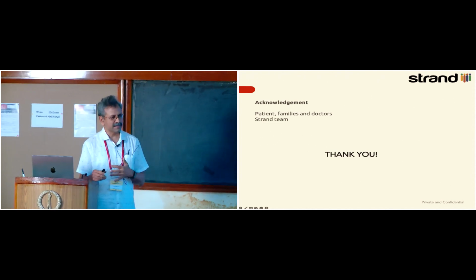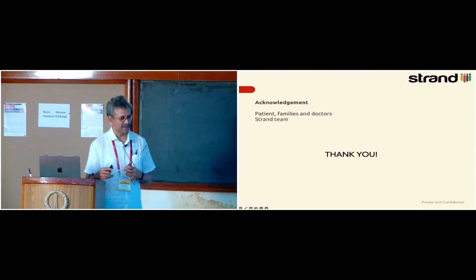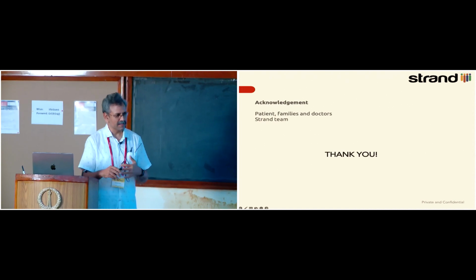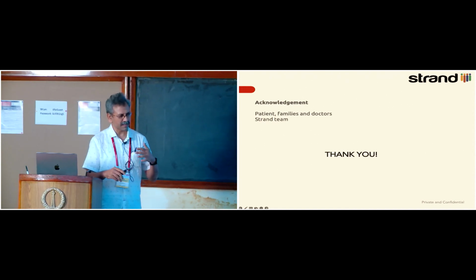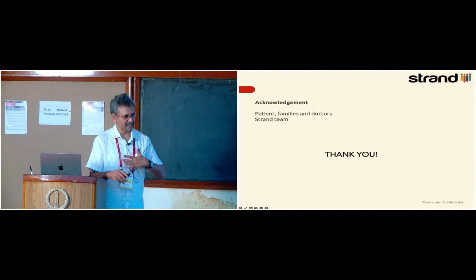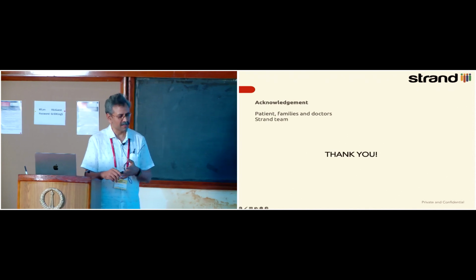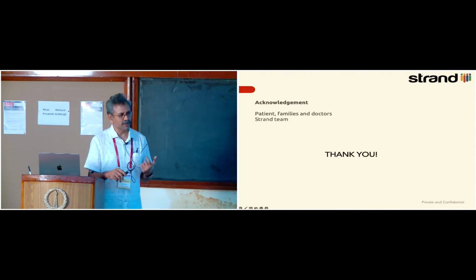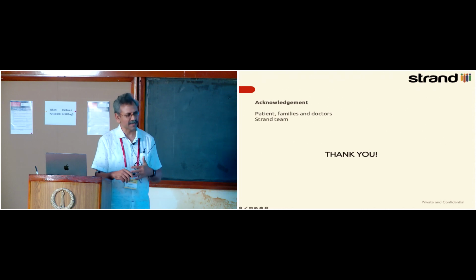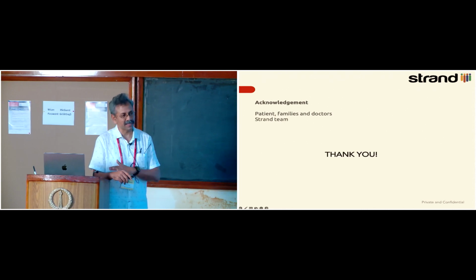Many of the clinicians that we interact with want to give an answer to a patient in a fairly short amount of time, so they are more interested in likely pathogenic and pathogenic variants. Even amongst the variants of uncertain significance, we have 5 different tiers in our internal scoring. The topmost tier of those, we convey to the doctors and ask, do you want it included in the report or not? Many of these intergenic variants, because so little work might have been done on them, may not have enough animal evidence, so they would not make it to any of those categories, and we would not be able to report on them in a diagnostic context.